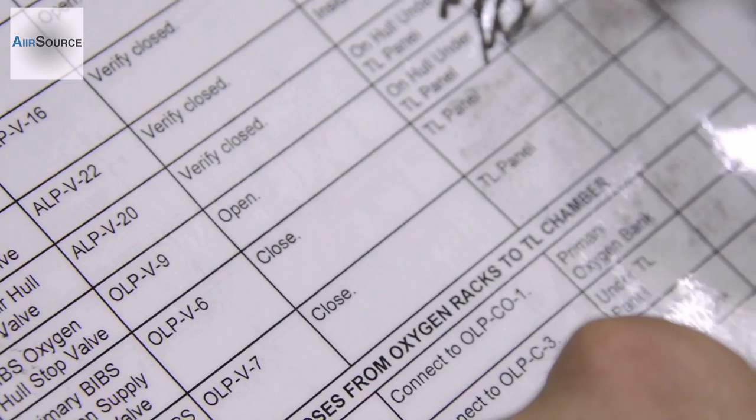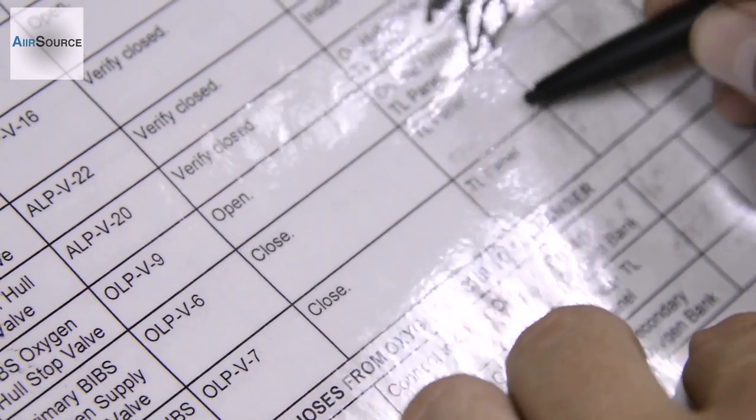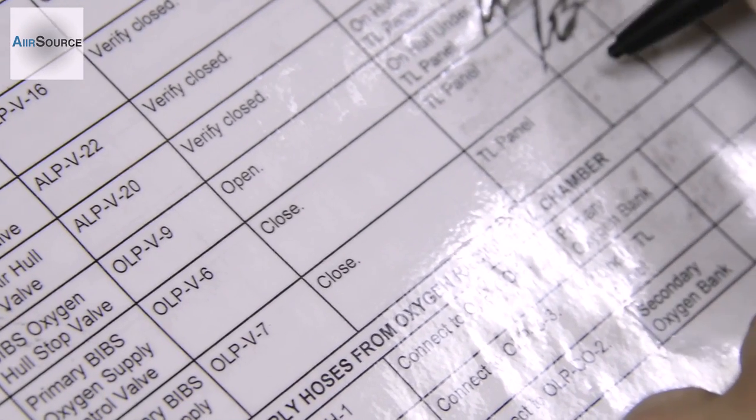Secondary BIBS oxygen supply control valve OLP-V-6 closed, shut. Secondary BIBS oxygen supply control valve OLP-V-7 closed.